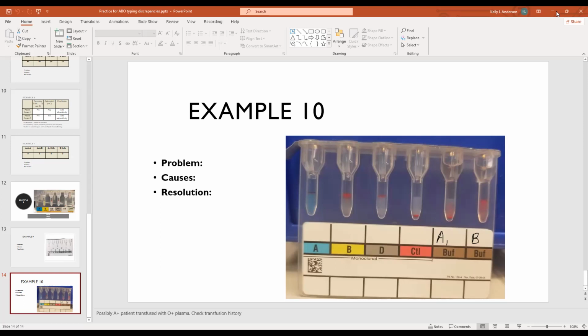No, and that's another thing. When you have nonspecific reactions, you're thinking it's a nonspecific protein or something causing it. Because if it's reacting with all cells equally, it's not a reaction to an actual antigen, so it's not an antibody reaction. It's a non-specific protein reaction.